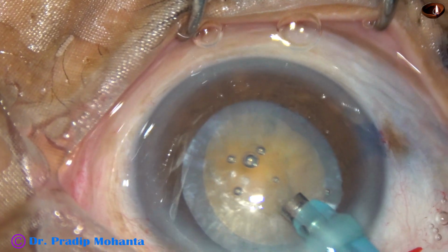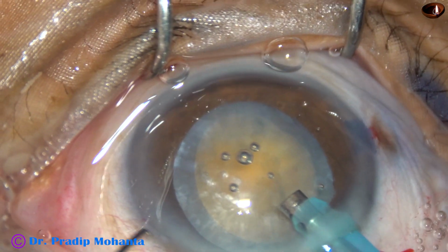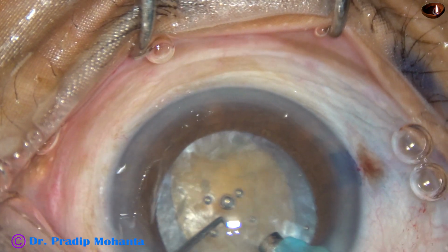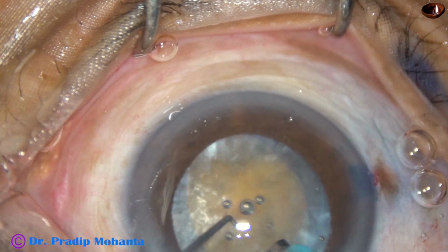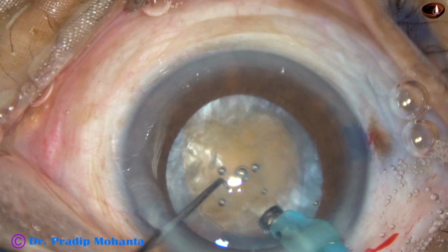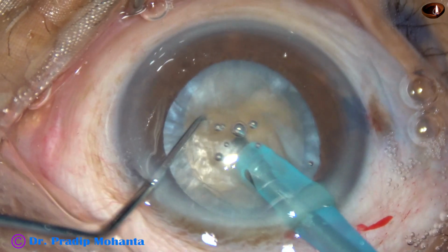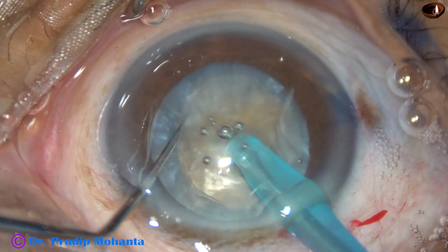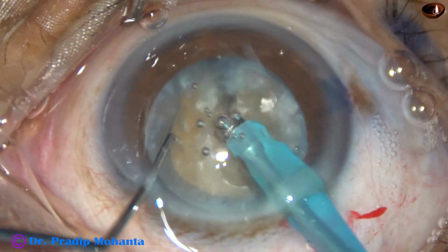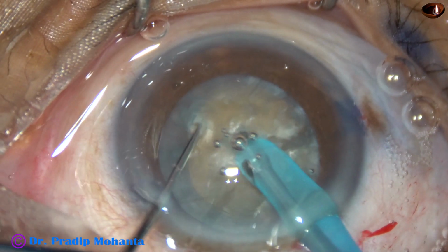By this time, the capsulorhexis has been done, and now I'm going to crack this nucleus into several parts. The tip of the Phaco handpiece is buried into the substance of the nucleus. I go through the substance of the nucleus for some distance, and then I use the chopper to crack the nucleus into two parts. This is a very good crack, and now this is the second crack.